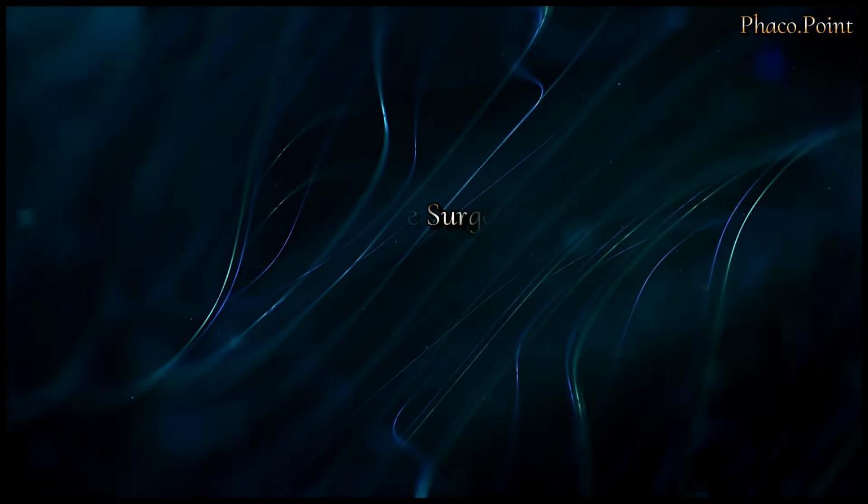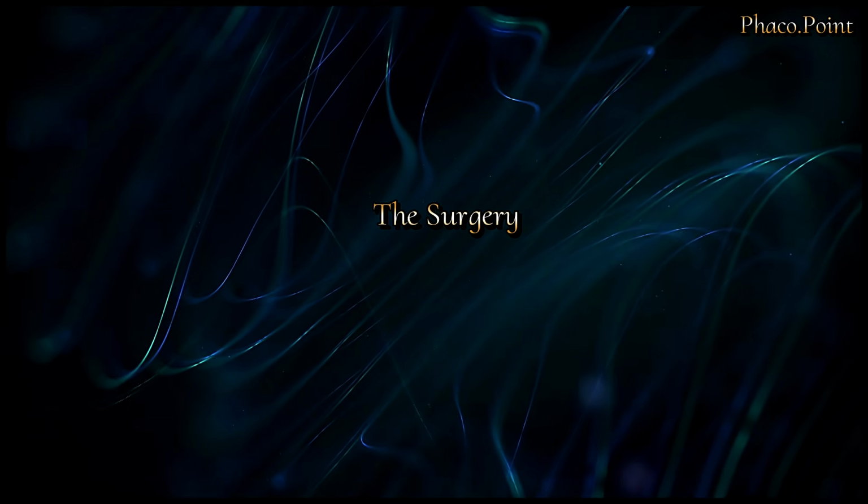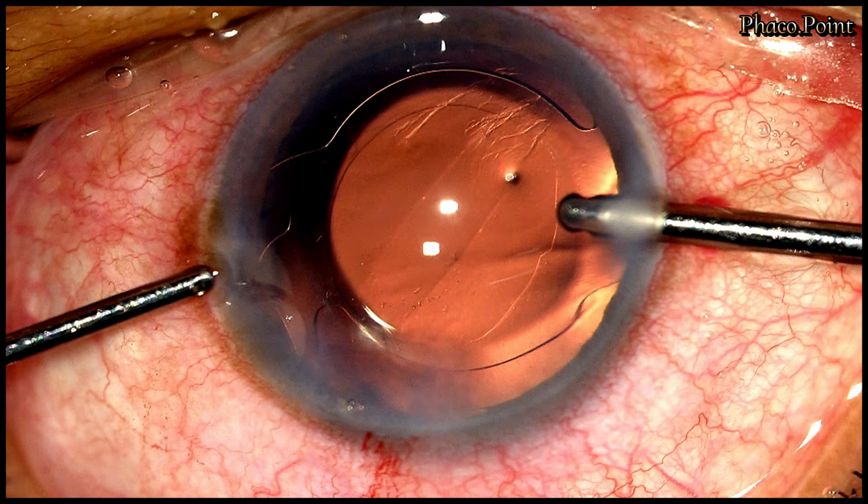Let's now watch a surgical case wherein we see folds in the posterior capsule towards the end of surgery. We start the surgery following the implantation of the IOL. Following an uneventful phacoemulsification, the surgeon has implanted a single-piece monofocal IOL in the capsular bag. Following the completion of the IOL implantation, you can see these folds in the posterior capsule.